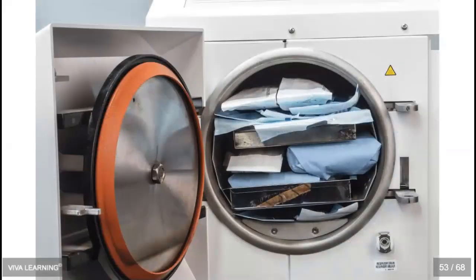Obviously, this is my statement that I always say, Houston, we have a problem, because this is a misloaded sterilizer that I guarantee you the contents are not going to be rendered sterile as a result at the end of this cycle. Just because you can fit them in like this does not mean that it's best practice.